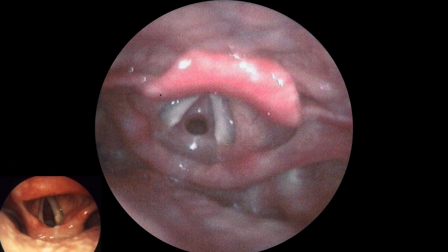Compare that picture to this one. Here, we're looking at narrowing past the vocal cords. That's called subglottic stenosis.